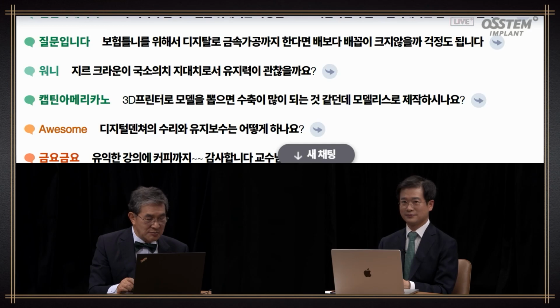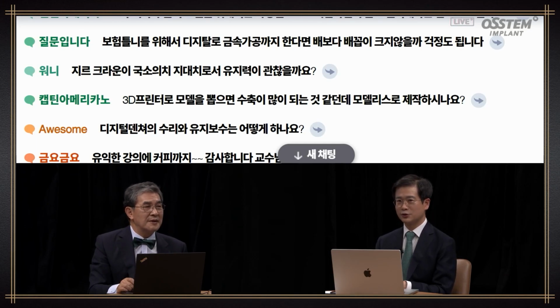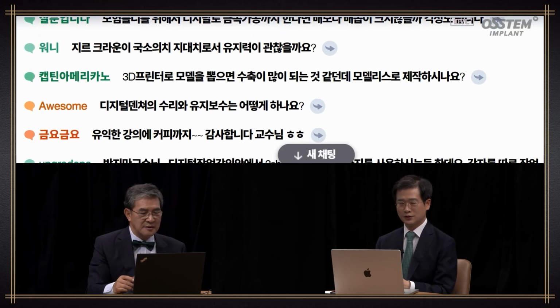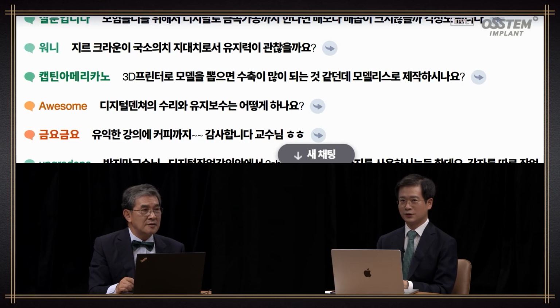And one question is, is the zirconia crown good in terms of retention? I think you showed the zirconia crown. JPD's annual review looks into the trends from the articles they carried around the year, and they said monolithic zirconia crown is literally okay.